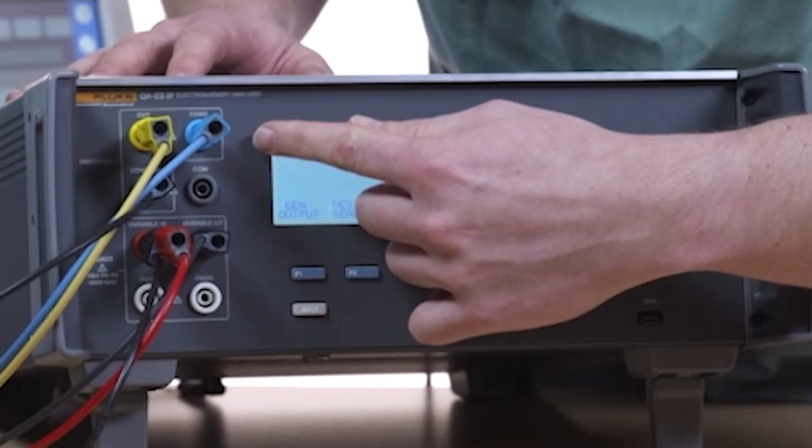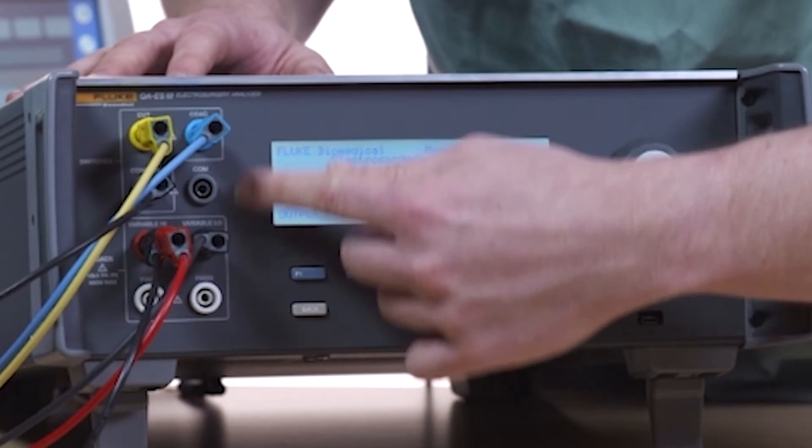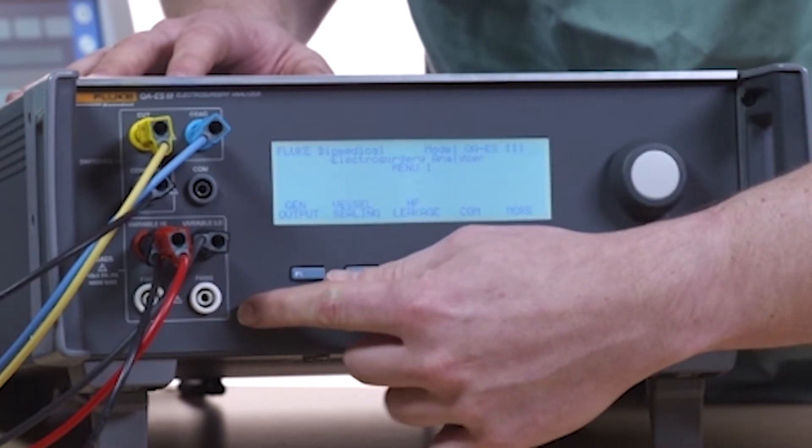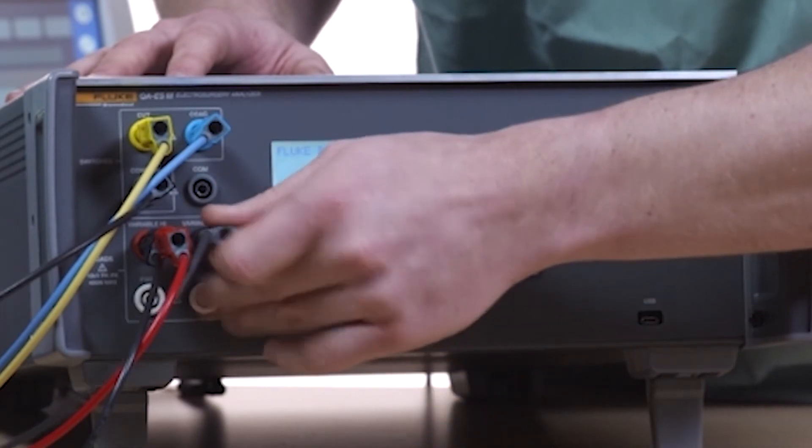Use the same setup as a generator output or power distribution test, except disconnect the variable low jack from the shorting leads.